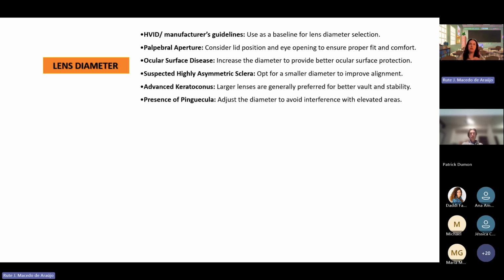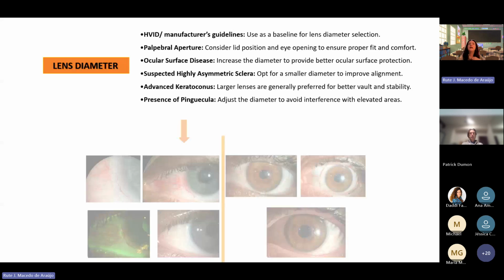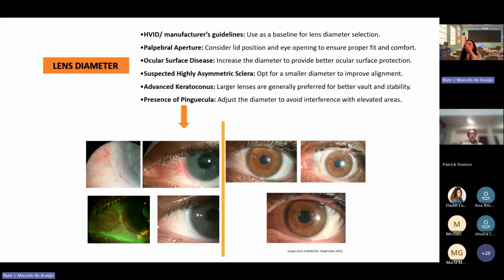So if we suspect that the patient has a big, highly asymmetric sclera, go near the limbus. Also, advanced keratoconus, probably we will need increased diameter to have better clearance and stability on the eye. And when we have other things like presence of pinguecula, we need to adjust the diameter to avoid interference with the elevated areas.